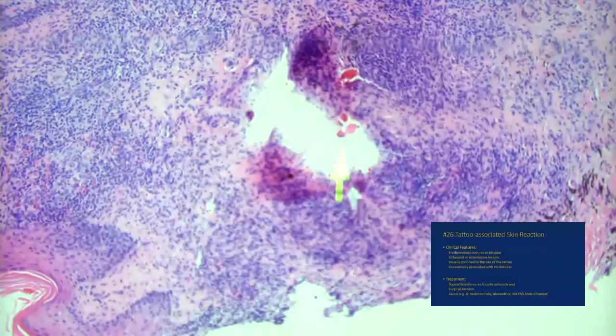This is why you don't want to get tattoos. Thank goodness it didn't do what I've got on the right in the corner. That's causing the ulcerative reaction. So there's lots of different kinds of reactions to tattoos. This is nothing special. It just shows an unusual, diffuse, kind of almost pseudolymphomatous type reaction.